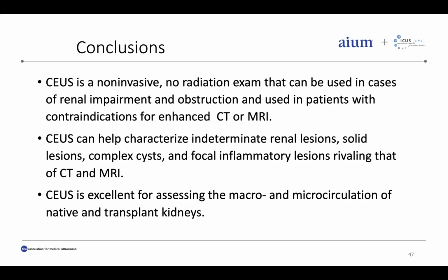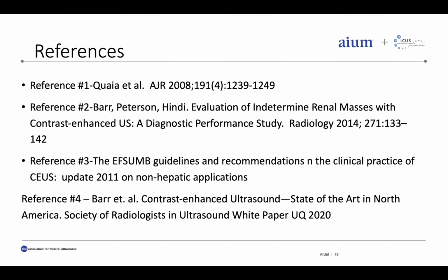An excellent way of assessing the macro and microcirculation of both native and transplant kidneys. Here are some references. I would recommend that you look at the state of the art in North America by the SRU. This white paper was published in Ultrasound Quarterly very recently.